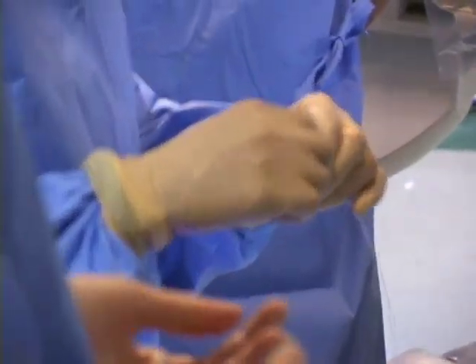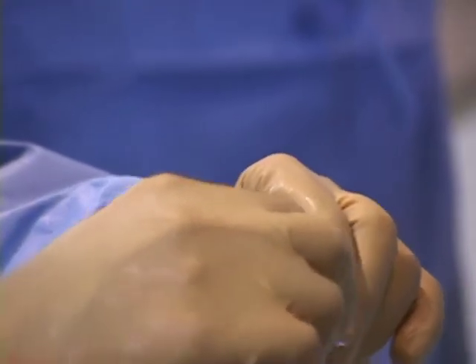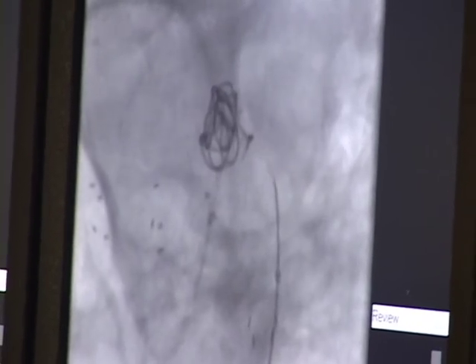The goal of the aneurysm treatment has always been to exclude the aneurysm from the circulation. The bare platinum coils work by filling the aneurysm to a substantial degree, 25 to 30% of the volume of the aneurysm is filled by the platinum. And then the blood flow is slowed. As the blood flow is slowed, clot forms. As the clot forms, the hope is that the clot will organize and fibrous tissue will have formed.